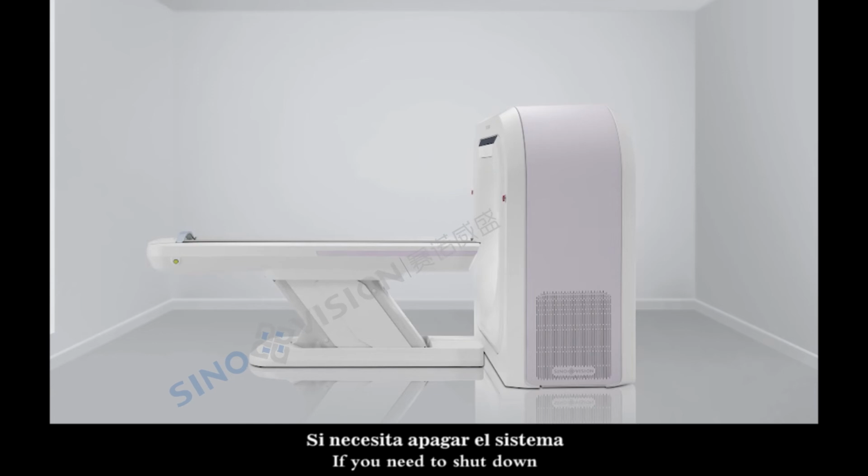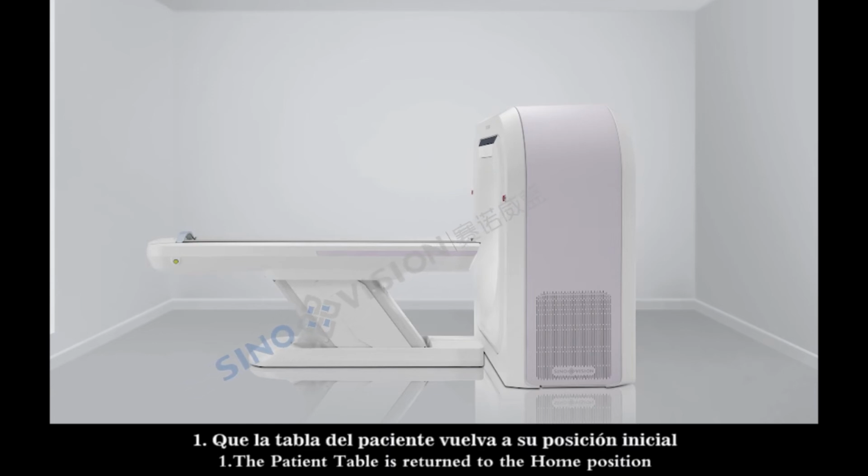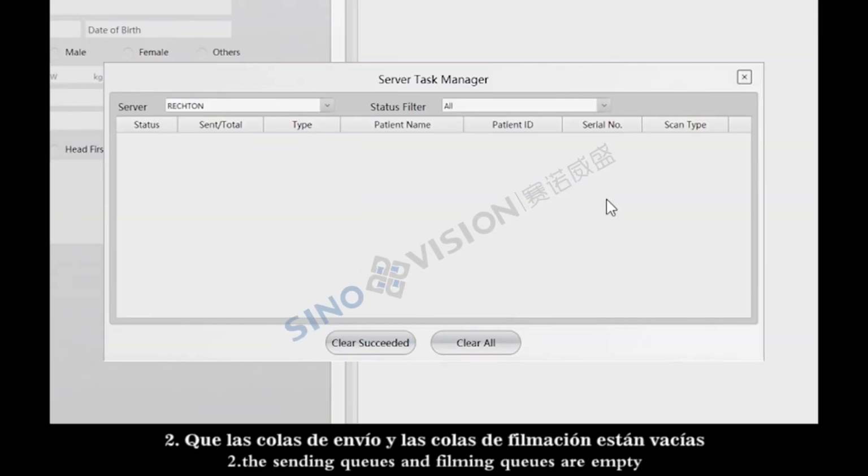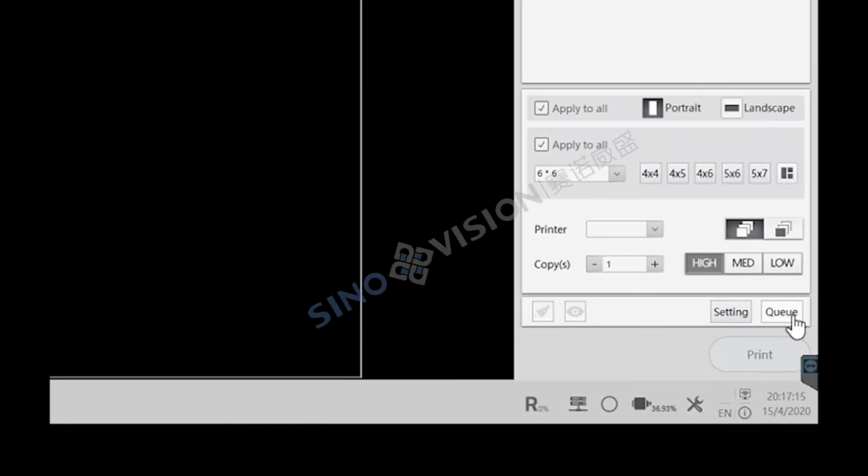If you need to shut down, it is recommended to check that 1. The patient table is returned to the home position. 2. The sending queues and filming queues are empty.